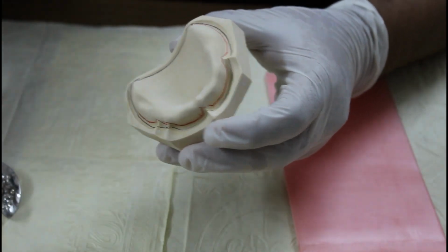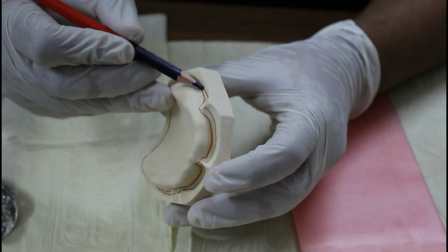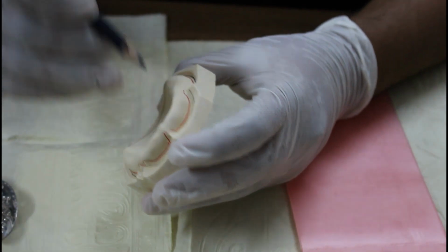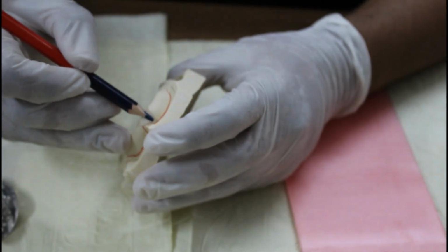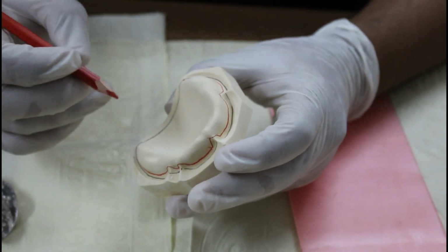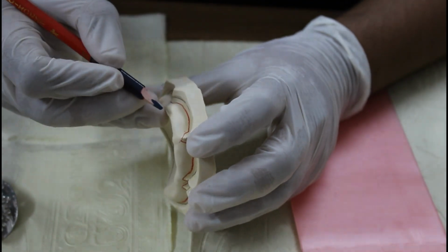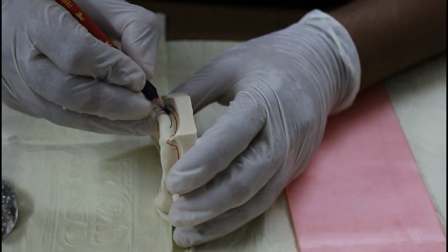Now we'll mark the third line using the blue color. Now this second line is called the tray line. The first line is called the sulcus line because it is in the vestibule. The second line is called the tray line. Now we will mark the third line. The third line we will mark with blue color, again 2 millimeters above the red line. So we mark it like this.